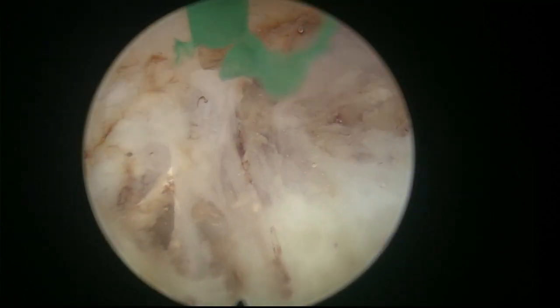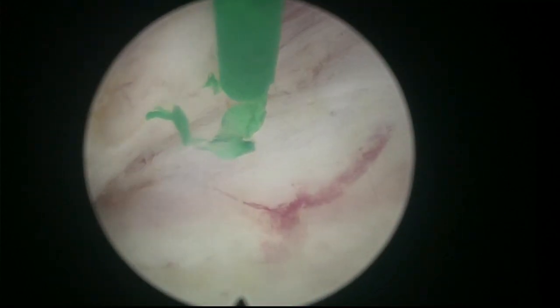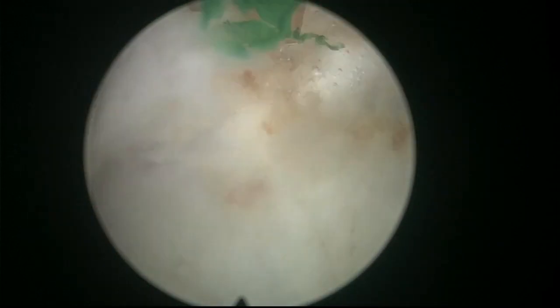Coming up to see if we can come out at the bladder neck level. Yeah? That's possibly very close to the bladder neck. So I was pushing a little bit with the scope to generate some. That's the plane. There's a bleeder here, right here. Let's see if we can control it.